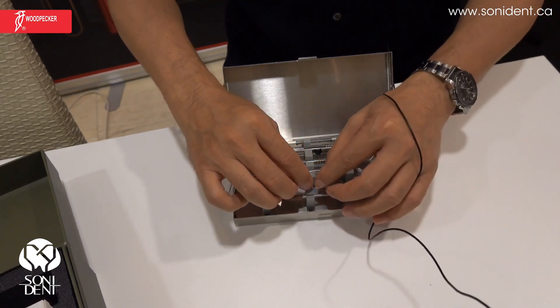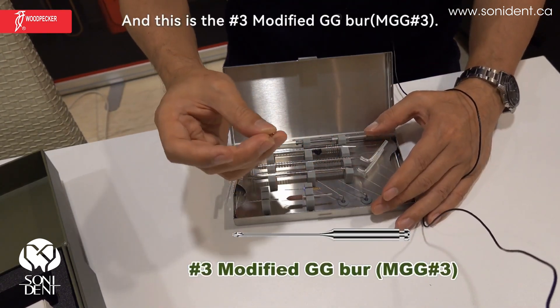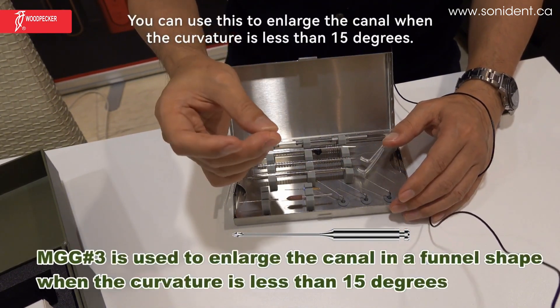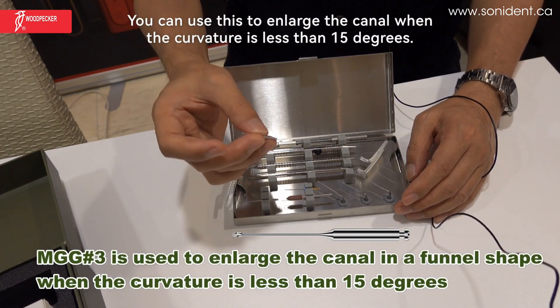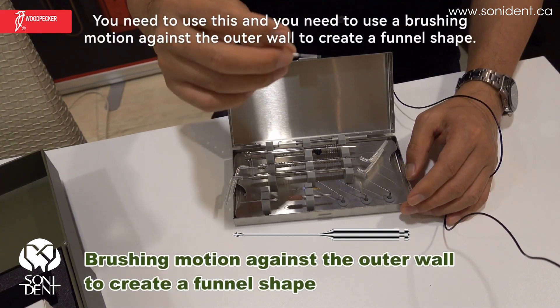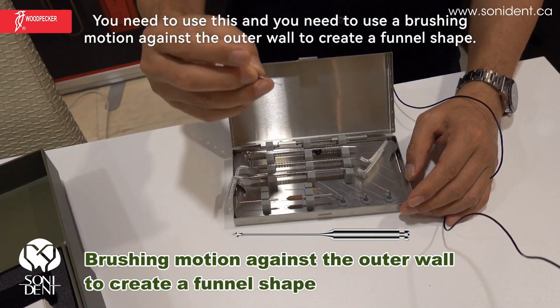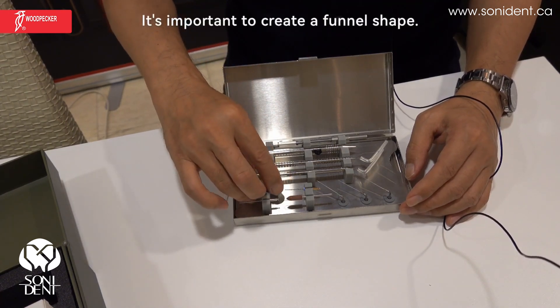And this is number three modified GG bur — there is no pilot tip. You can use this to enlarge the canal when the curvature is less than 15 degrees. You need to use the brushing motion against the outer wall to create a funnel shape. It's important to create a funnel shape.